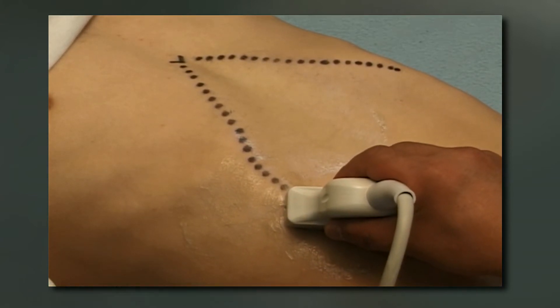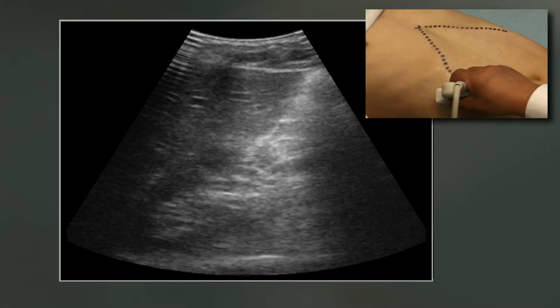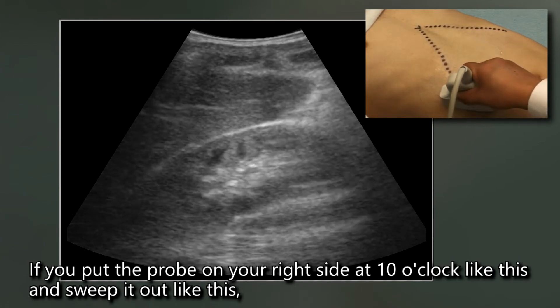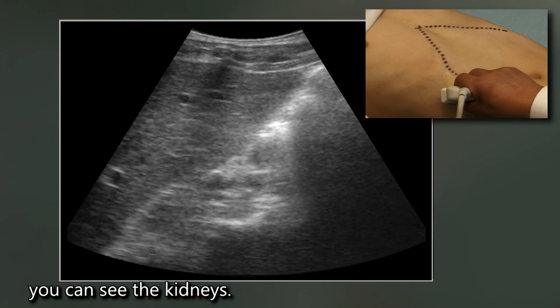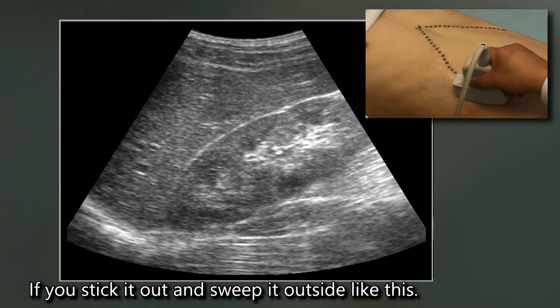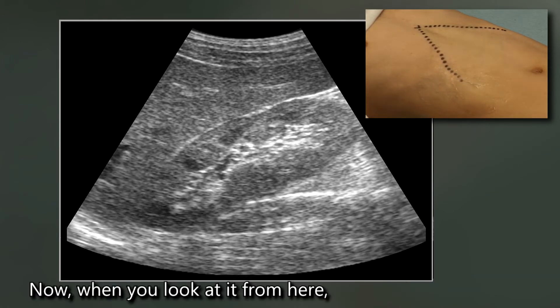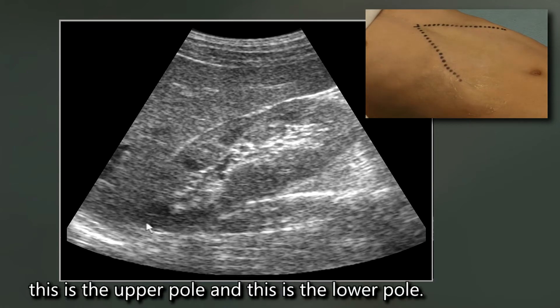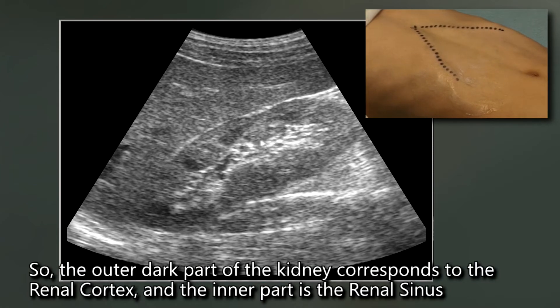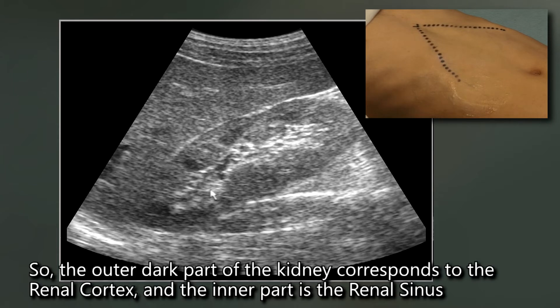Let's look at the right kidney first. The right kidney should be done on a longitudinal scan of the right flank. If you put the probe on your right side at 10 o'clock and sweep it out, you can see the kidneys. Stick out your belly, sweep it outside like this, and the kidneys appear in an oval shape. When you look from here, this is the upper pole and this is the lower pole. The outer dark part of the kidney corresponds to the renal cortex, and the inner part is the renal sinus.